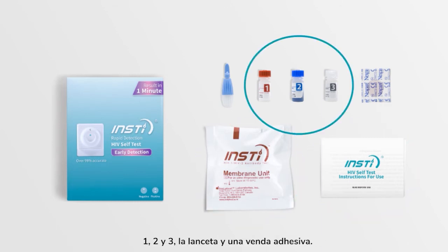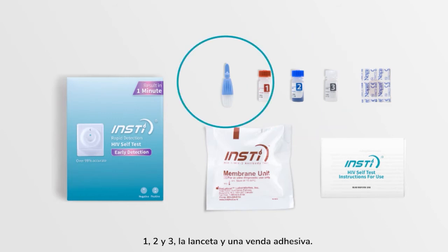The kit contains: the test device pouch, bottles 1, 2 and 3, a lancet, and a bandage.